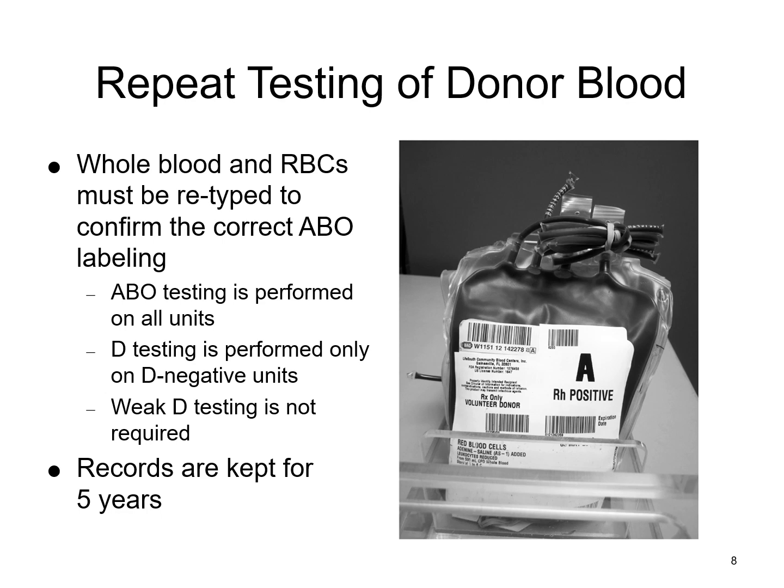But I mentioned earlier about these segments. You can see here where you've got this segment that comes off of this unit. So this part of it is still an open system. If you look real close, right here, you can see where there is some numbering on this bag.